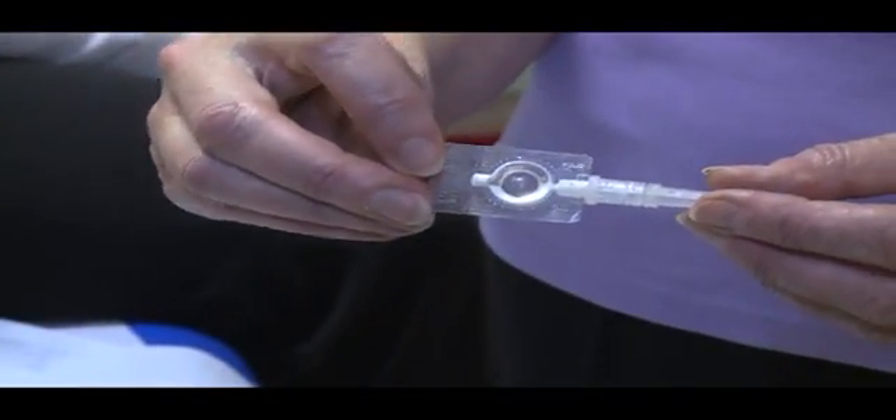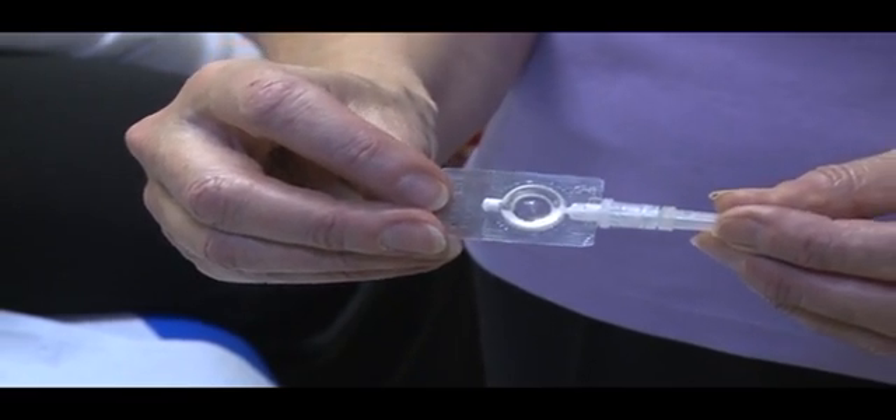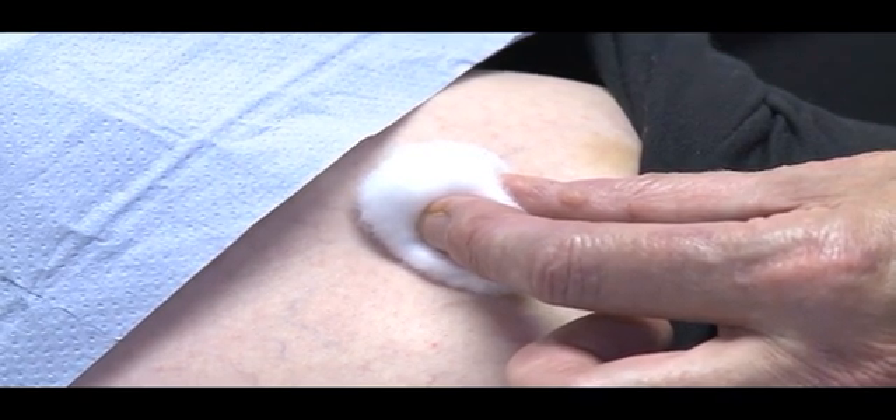It's important that the full dose of medicine is given to the patient. Small traces of the white liquid may remain visible inside the edge of the reservoir — this is quite normal. Now use a clean cotton pad to press lightly on the injection area for a few seconds, but do not rub. In the unlikely event that any of the medicine leaks out of the injector or appears around the needle, the patient will not have received the full dose, other than the possible drip effect mentioned earlier.